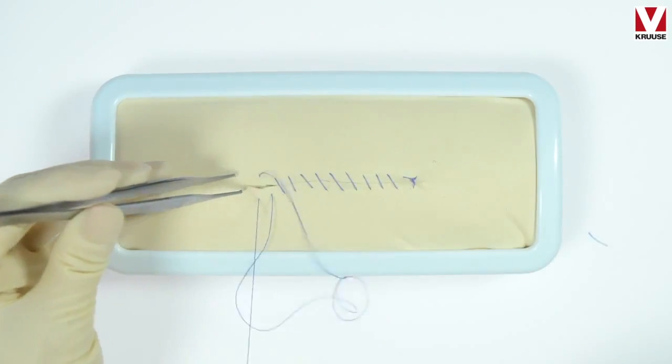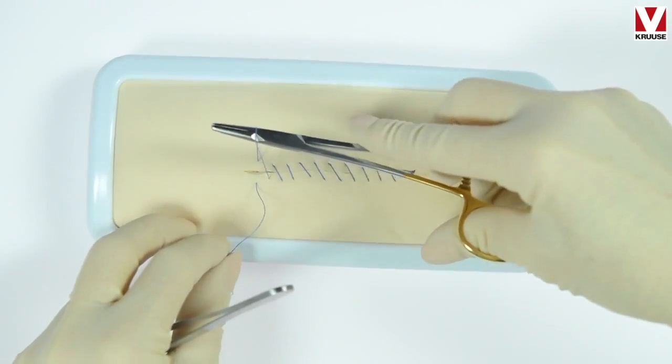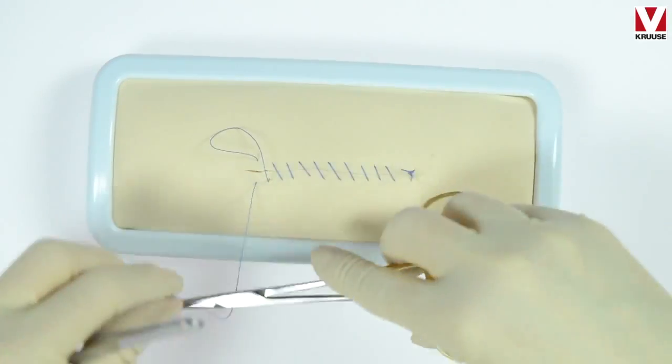Make a loop with the suture and use the loop to tighten the continuous pattern.